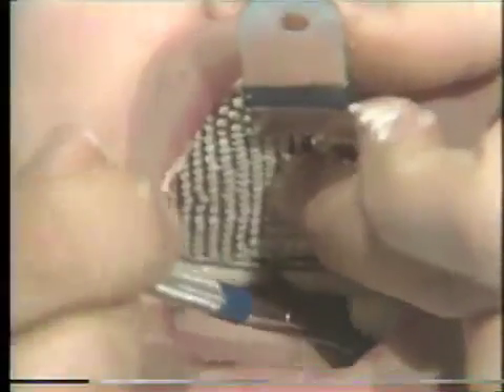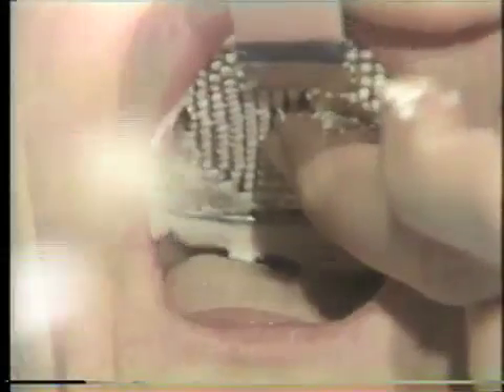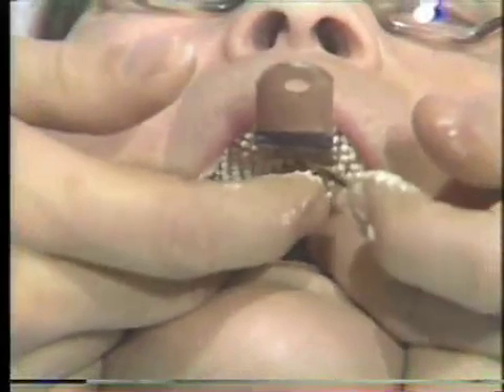With your mouth mirror, please open. Use the mouth mirror to scoop the alginate material from the back of the mouth. Ask the patient to relax the lip and hold the tray in place until the material is set.